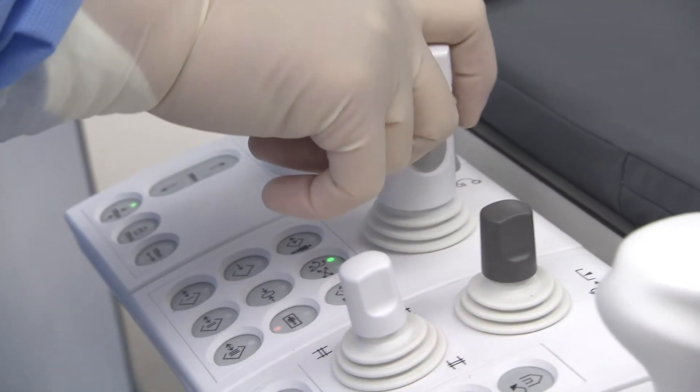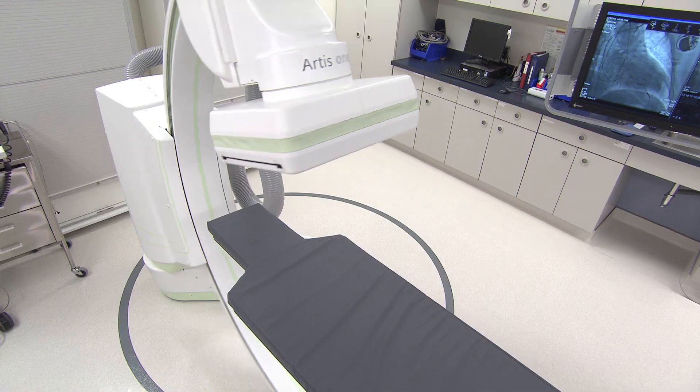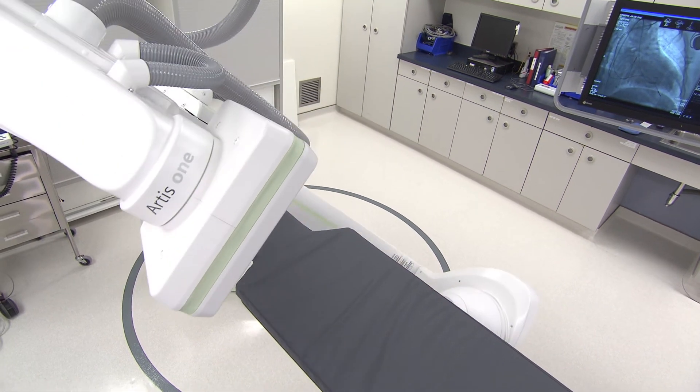The C-arm can be positioned in many different directions, and especially when you're doing peripheral procedures, you don't need to move the table.